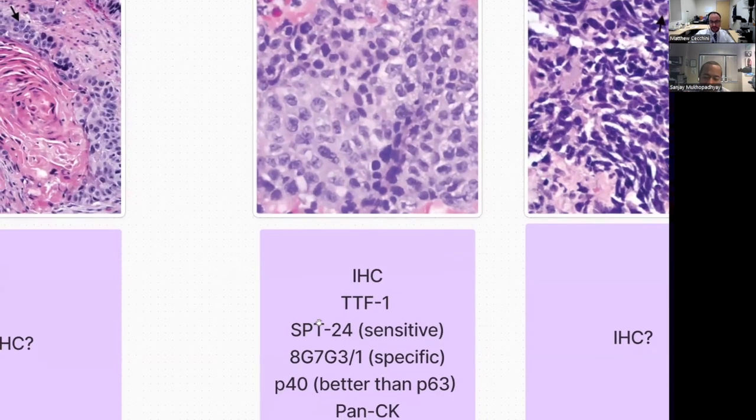Yeah, so my lab actually has SPT24, which, I completely agree with you, has some pitfalls, right? You can overcall it. I think it's okay as long as you know your tool. So I just know that mine is oversensitive and not always specific, and I can't rule out that it's just staining something else. So I always use it in context of other stains, and cognizant of that. In some ways, the ideal thing is actually having both, because I think they help you ask different questions, right?